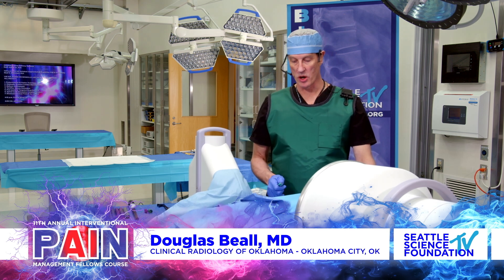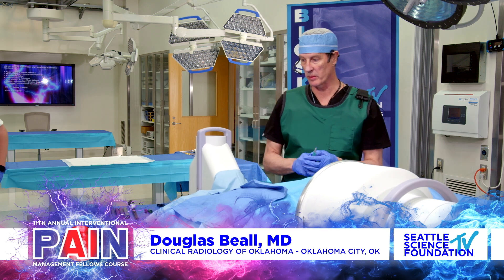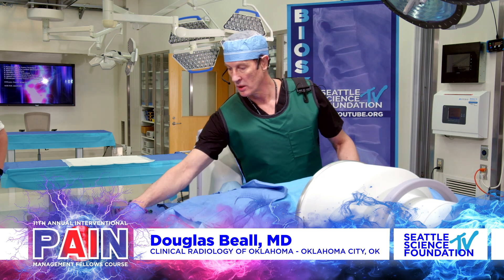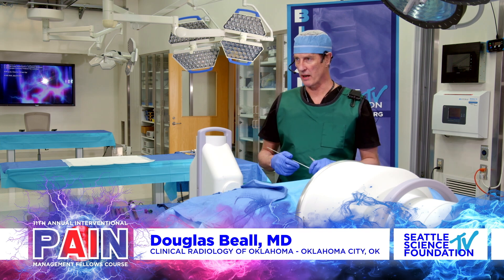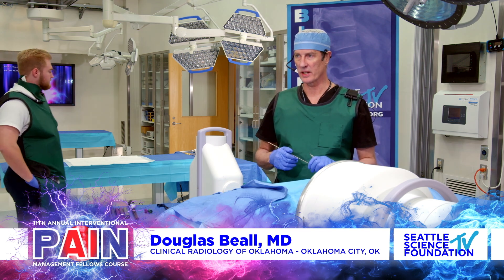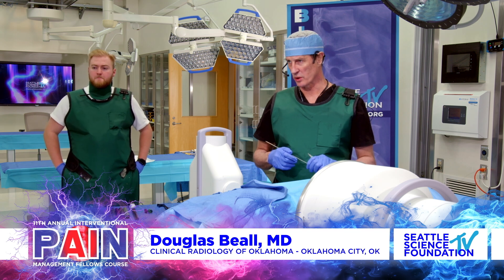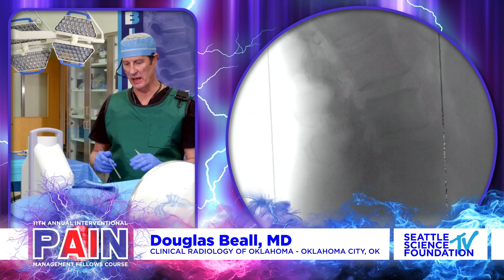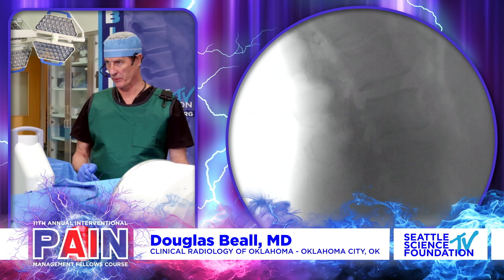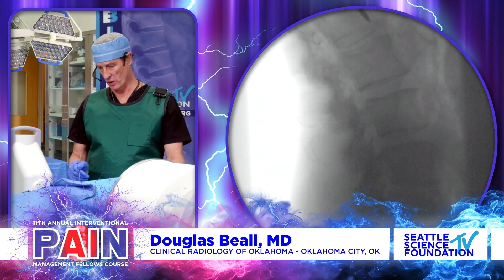So, this is a demonstration on an interspinous fusion spacer. This particular spacer is called the Minuteman. It's made by a company called Spinal Simplicity. And so, we're going to start off on a lateral view. We're going to start off really targeting the interspinous space and target this space that we can see here.